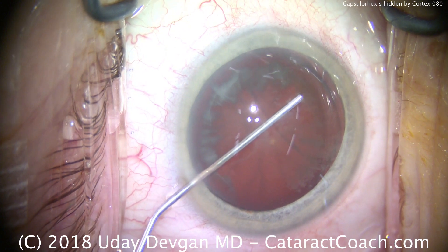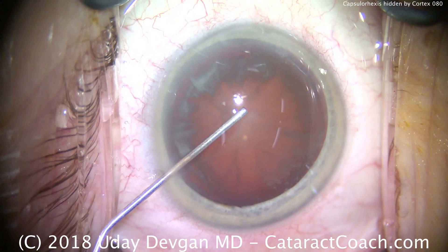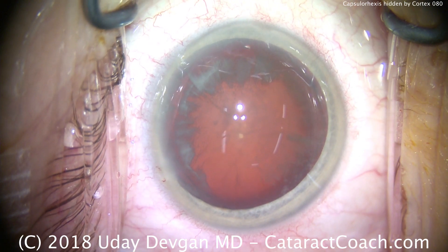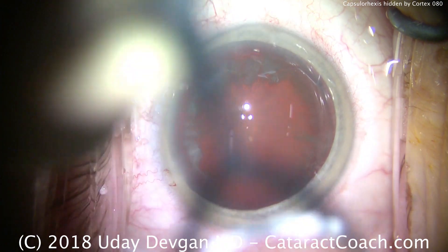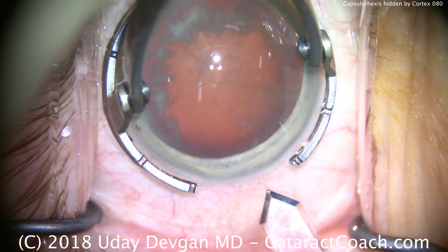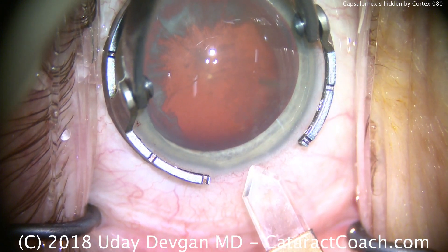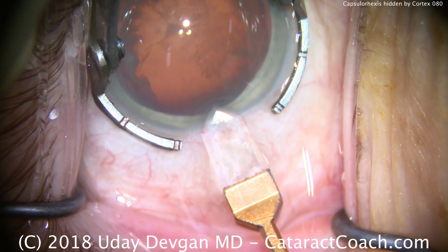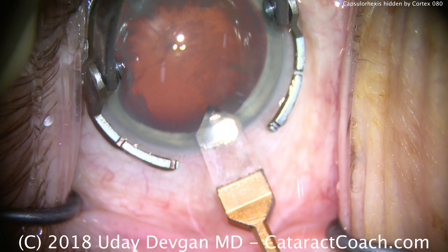We could certainly fire up the half-million-dollar femtosecond laser and use that to create the capsulotomy. But there's another way as well, and that's going to be to do our traditional capsulorhexis, but to be very careful of where we start and stop each grab of the capsulorhexis as we're tearing it. Let me show you what I mean.